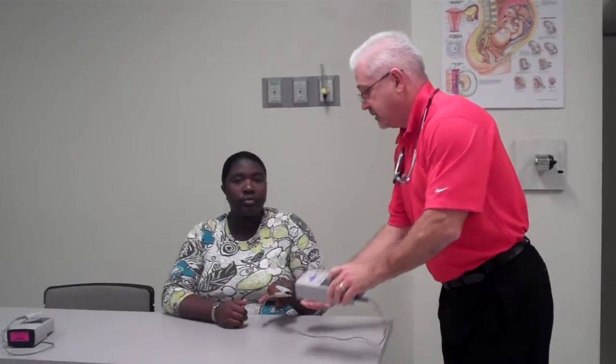If there was a family member in the room, I would go ahead and confirm with the patient it's all right if your family member stays here. And if that was okay, I would confirm with the family member that they understood. At this point, I would go ahead and do my assessment of the patient. I would check the patient's heart rate, respiratory rate, and saturation with a pulse oximeter, putting it on her finger.